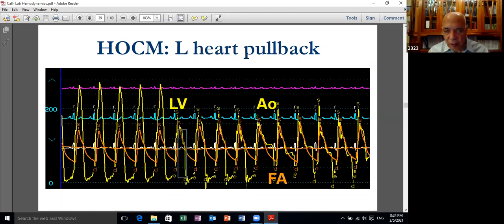And then as you go through the aortic valve, there is no gradient, obviously. So the gradient is essentially proximal to the obstruction, but you have three parts of the picture. You have left ventricle proximal to the obstruction against the aorta. You have left ventricle distal to the obstruction and the aorta, and you have left ventricle beyond the aortic valve. So it's the aorta against the aorta, and there is no gradient.